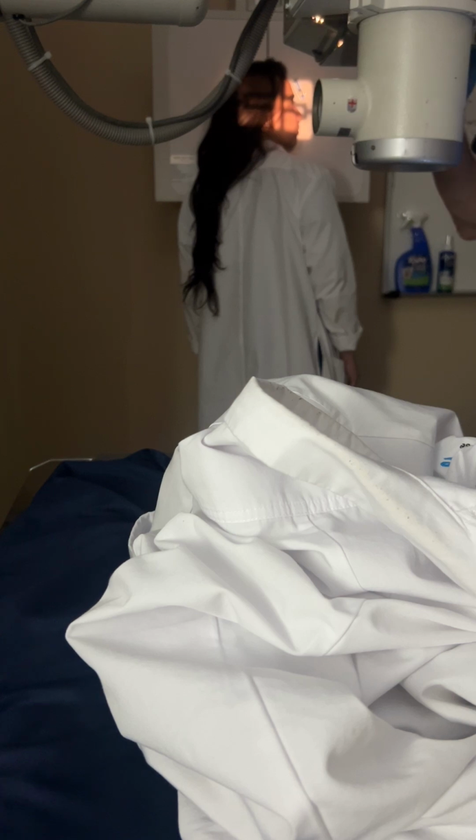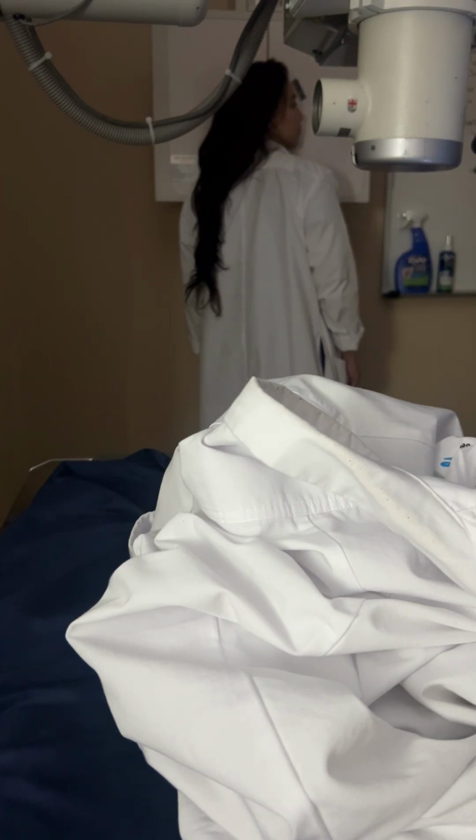And we're going to collimate down to just the area of the sinuses. You said 1 inch posterior? Half inch to 1 inch posterior to the outer canthus. So about right there. A little higher, not exactly the same as mid cheekbone. So about right here, maybe below the temple? Half inch posterior to the outer canthus. I'm not using easy words. You guys need to know this, okay? That's how I'm understanding. When I look at it, I can see it, but to say it out loud is harder.